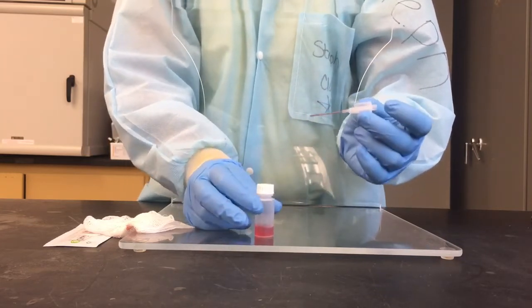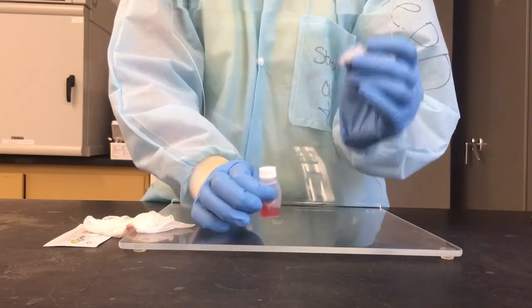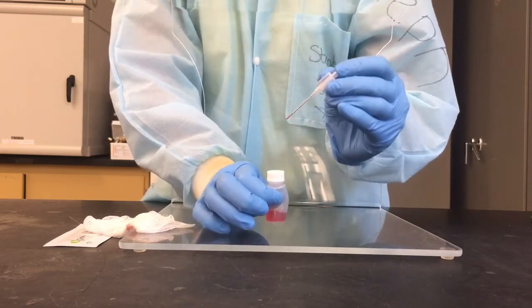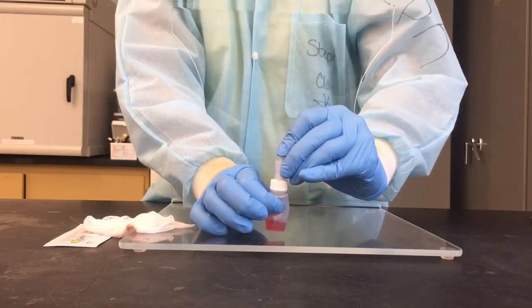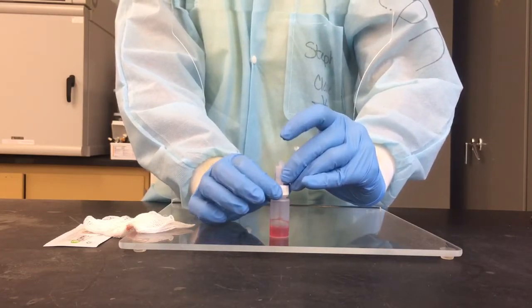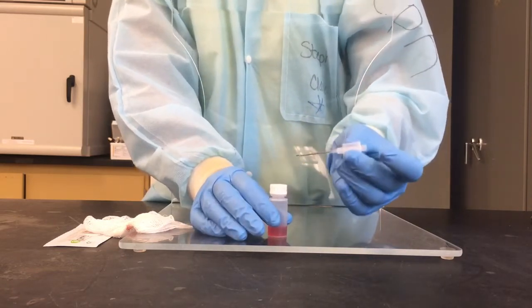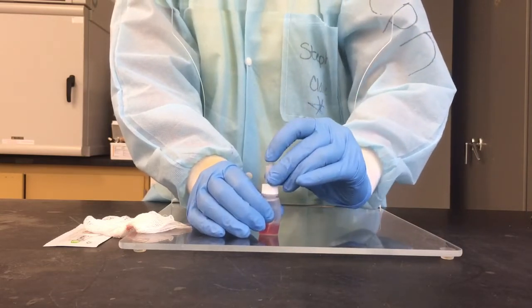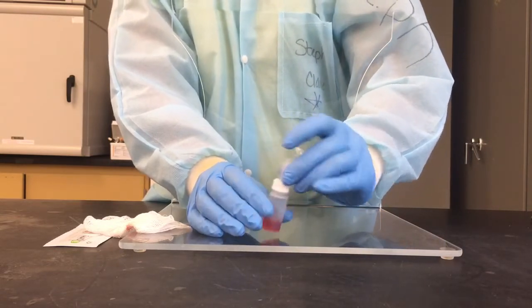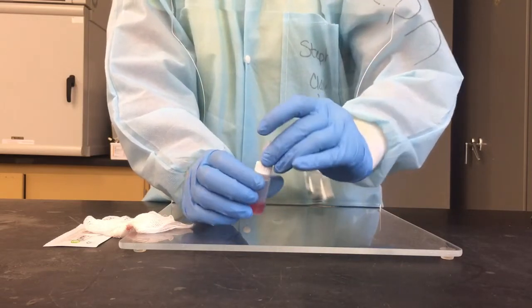So the way that I want to do this is by, again, doing the same thing. I want to squeeze the reservoir together, finger over the top of the capillary tube, seat the assembly again, let the reservoir go, and then let my specimen go. Now again, I'm getting better, right? I'm rinsing more and more out every time that I do this. Oops. So out, let that go out, and we're getting a little bit clearer every time, so that's good.